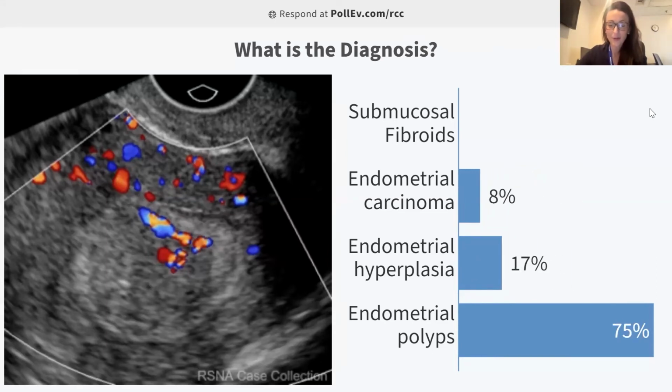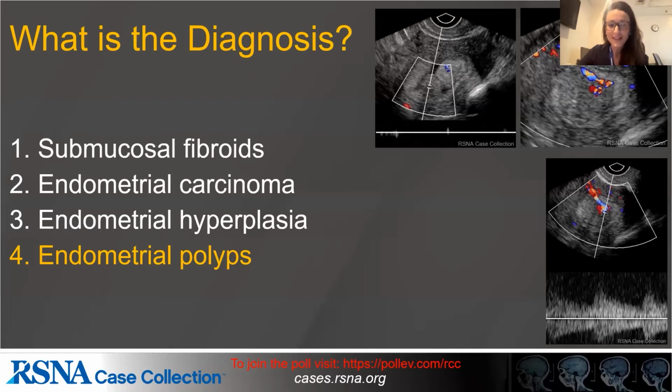Great. You have a few more minutes to get your answers in. It looks like we're reaching consensus here. So yes, the diagnosis here is endometrial polyps.